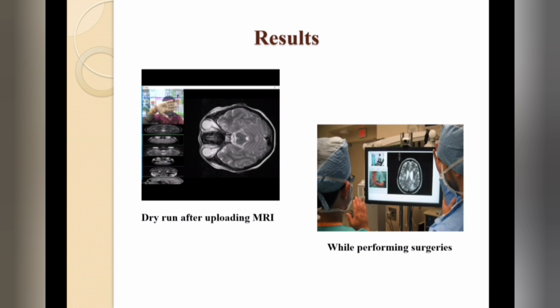After uploading that, the webcam will automatically be enabled. After that, the image will automatically be manipulated based on the hand gesture that is provided by the doctors. So the hand gestures will act like rotating, zooming in, zooming out the images, previous image and the next image. So in this image, we are seeing that our project is running while performing a surgery.